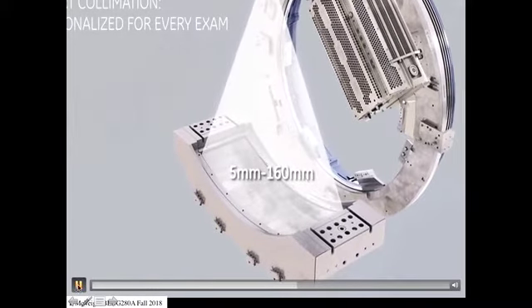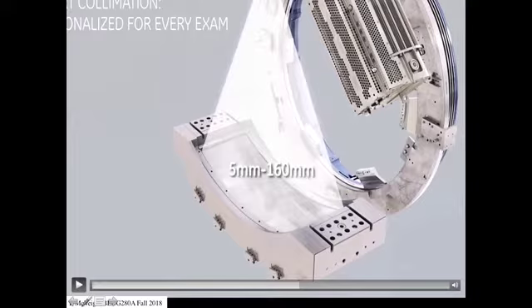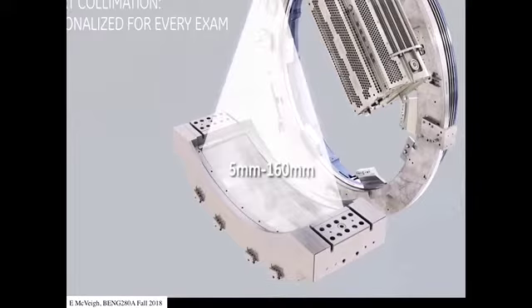This thing here generates a high voltage between the anode and the cathode in the X-ray tube. Okay, and you guys review back, think about X-ray generation. Remember, we needed a high voltage between the electrons burning off the cathode and hitting the anode. So this generates up to 140 kilovolts, and it goes down to usually around 70 kilovolts is the lowest differential, because that's the range of electron energies that produce X-rays with the right energy spectrum to go through a person.